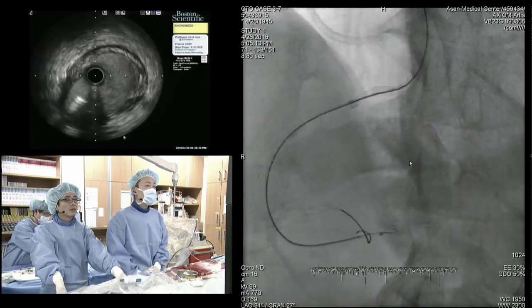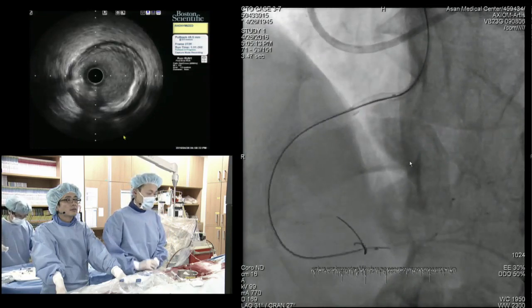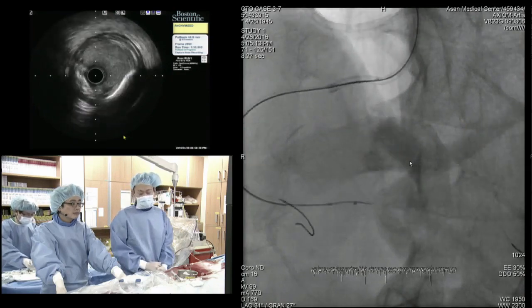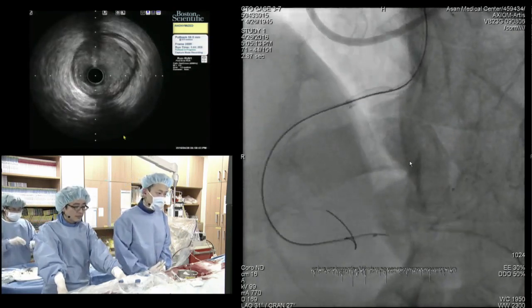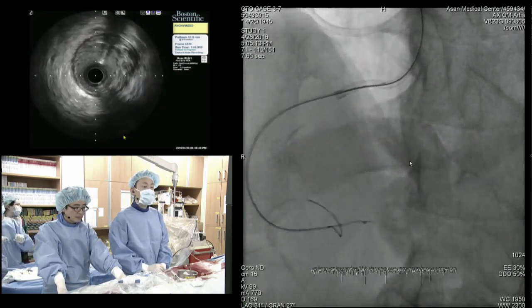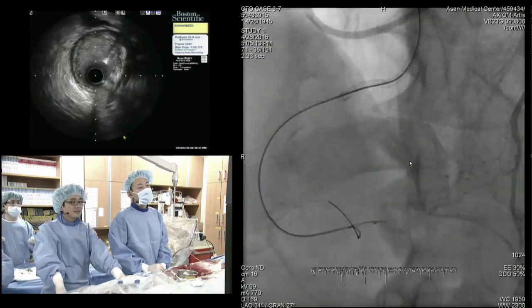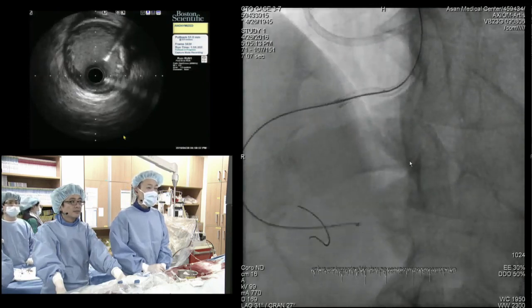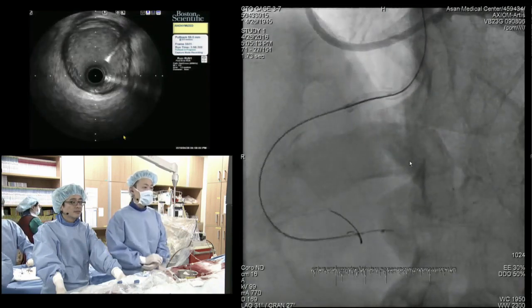So this is the branch. You can see the wire. The proximal side is fine. So I would like to deflate the 2.0 now, check the IVUS, try to select the PD branch and put the stent. Stent from where? After crossing the PD branch I would like to decide, but maybe the AB is better, I guess. But it's very difficult to decide now.